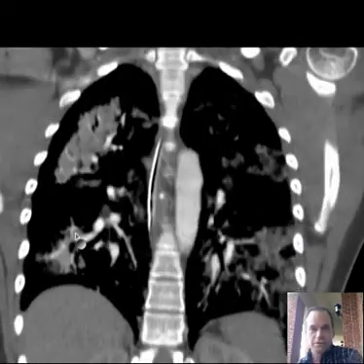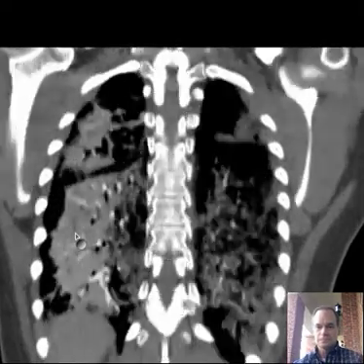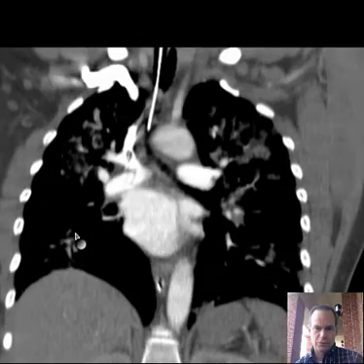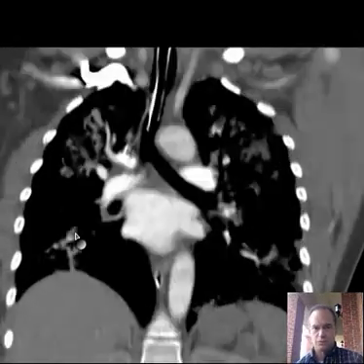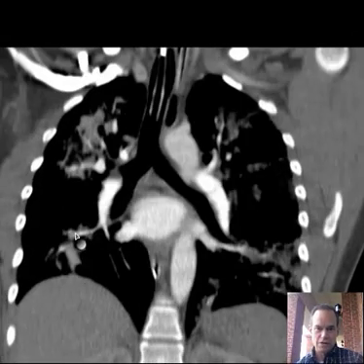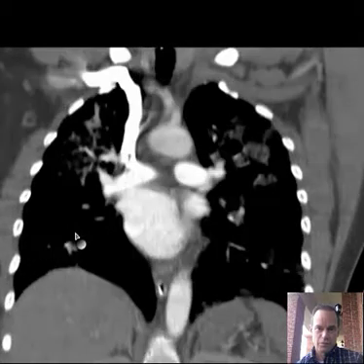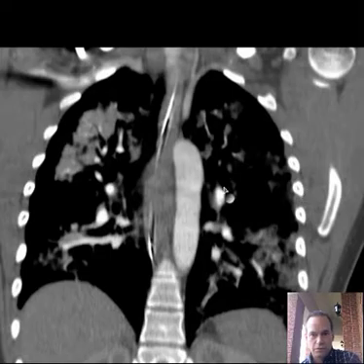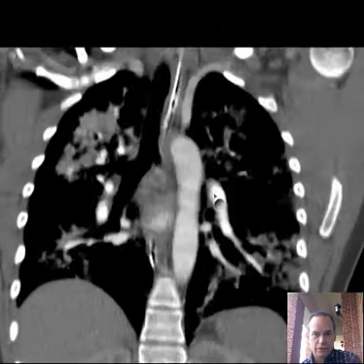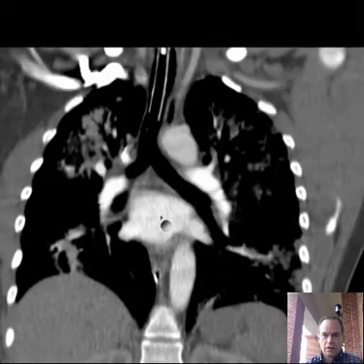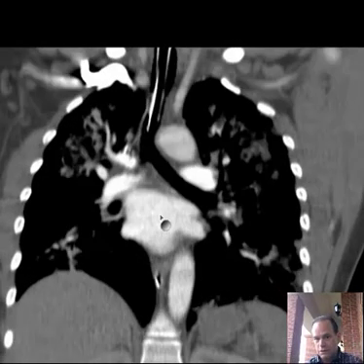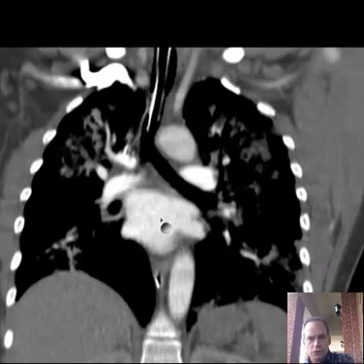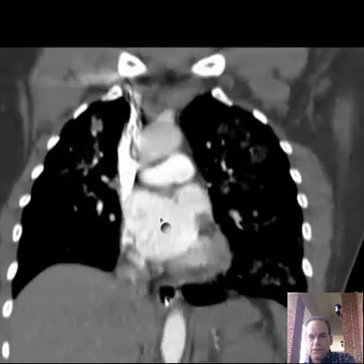So here we have the coronal view. You get the same kind of information, but it comes together a little more quickly because here you can see the pulmonary arteries on each side giving rise to the respective branches on the left and the right. And here you see the left atrium. Remember that was one of the questions on the test — it seemed to be difficult for some of you.